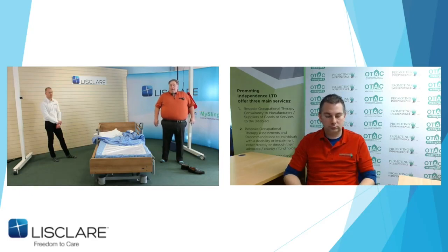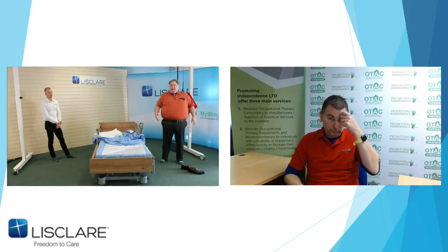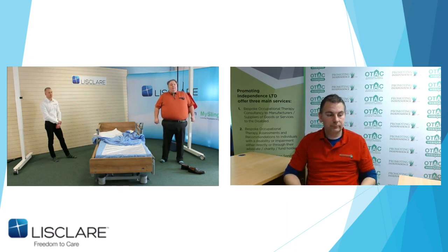You can spot clean, but in the community setting, the biggest argument usually you get is how many sets do they get? You know, you go into somebody's house and it's a nice hygienic house and the wife or the family would wash the sheets at least once a day because obviously it depends on urine and Inco pads, etc. And the Inco pad always goes on the top of the 4-way top sheet. But to be honest with you, you can wash and tumble dry these and have them ready again in an hour.